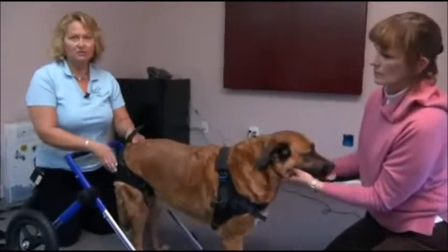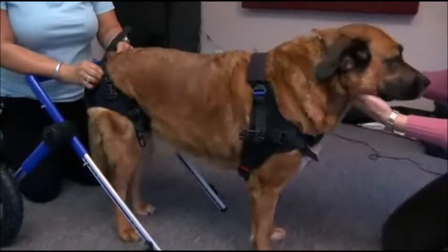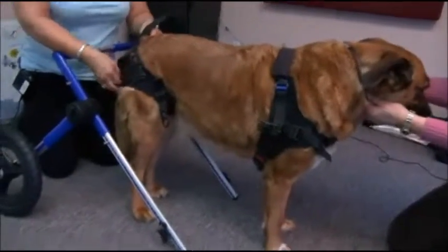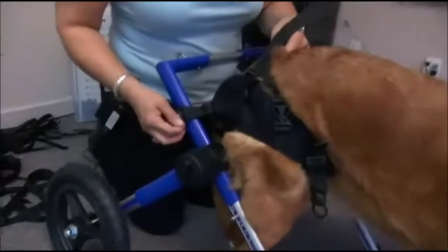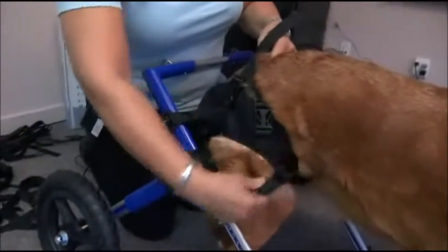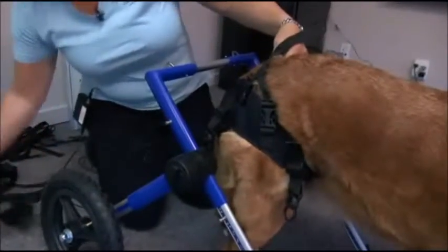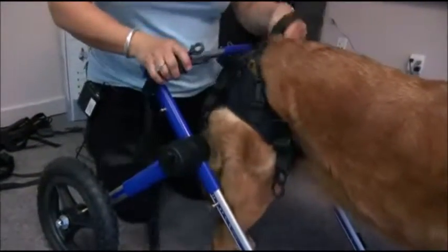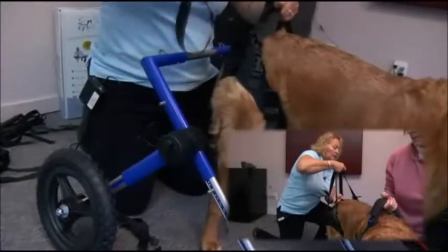Now we have Jake in the optional rear harness, and this is really good to use for heavier dogs because it gives them more support than the leg rings. It is compatible with the wheelchair, so it would clip right in. The handles can also be used to clip onto the round rings and help them along with the handle straps.